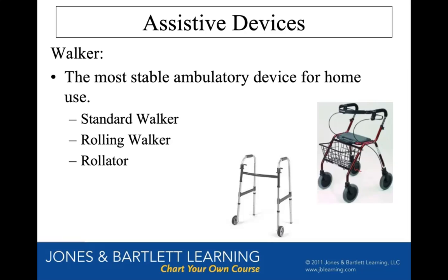I have a question. Okay. So those little cords on the side of the rollator, are those like hand brakes? Those are the locks. Yes. Oh, the locks. They lock the wheels. They look just like what you see on bicycles, honestly. But don't think of them as brakes, because it's not like if they get going too fast, they can press on them and it slows them down. It doesn't work like that. They have to push them, and it's either locked or unlocked. But those wires go to the brakes on the wheels, just like a bike does.